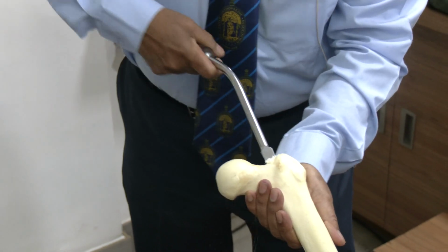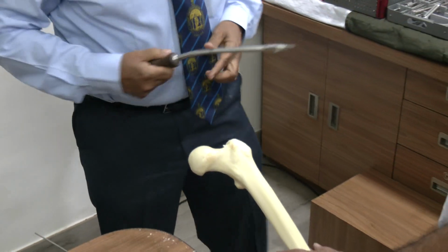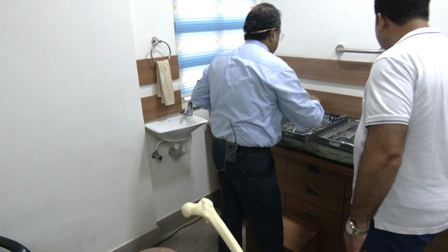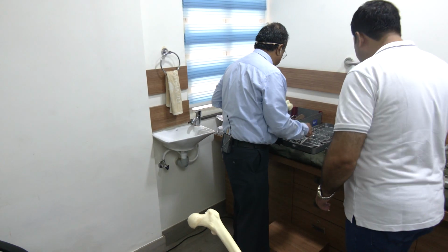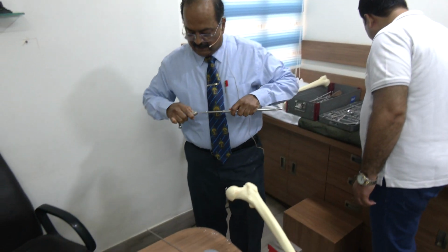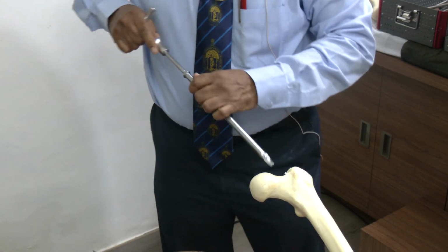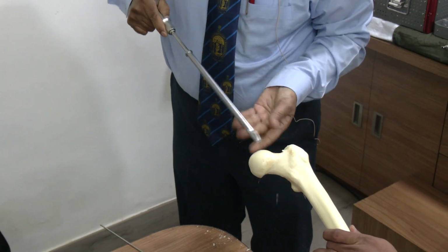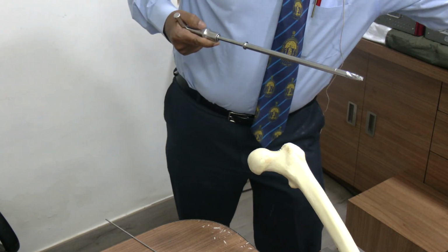But since it's a bone model, what I'm going to do is first I'll remove some of the bone inside, then we'll use the proper instrumentation, the T-handle. Otherwise, I will be just wasting time during the course of this surgery. So what I am going to do is, I just want to take out the medullary canal.